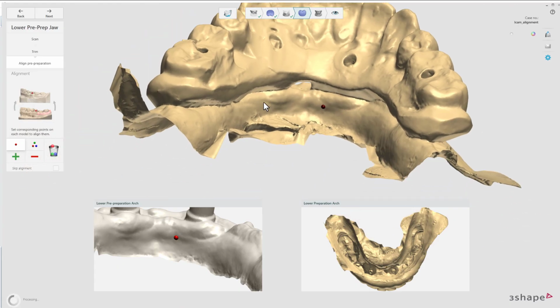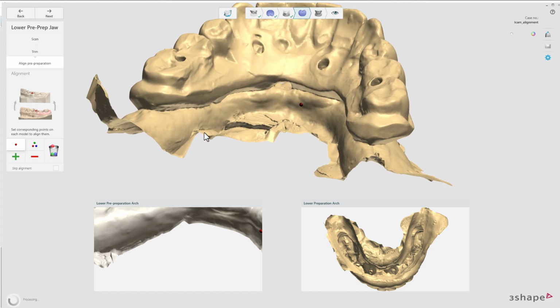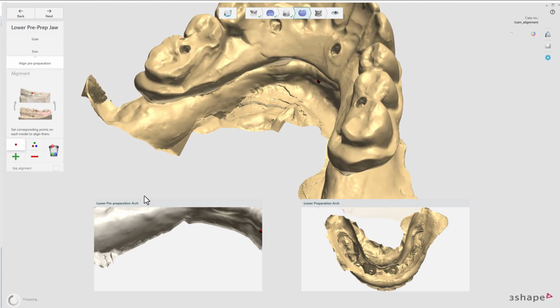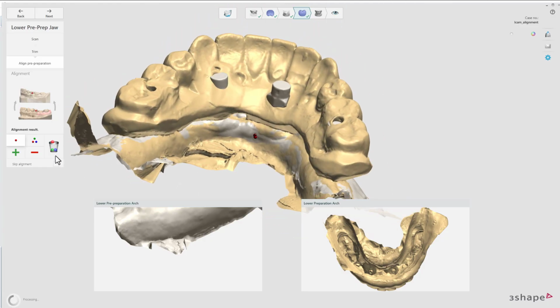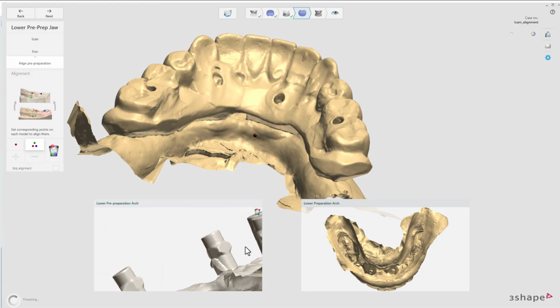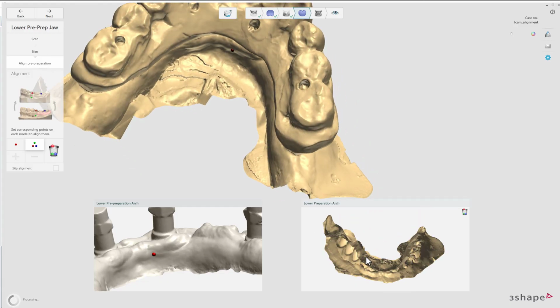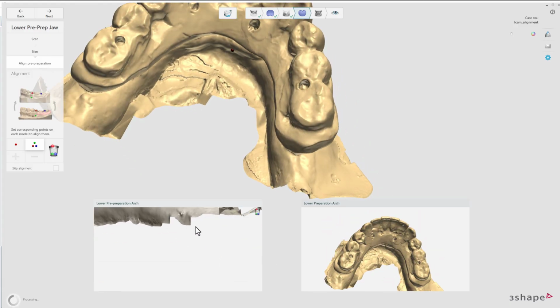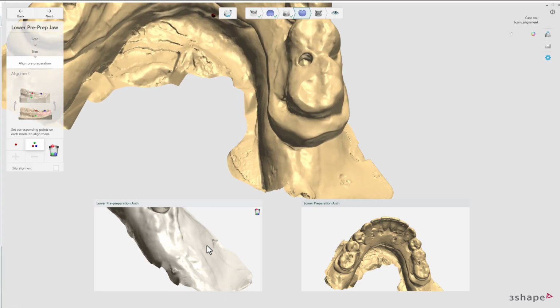It's gonna be right there. And you'll be surprised, a lot of these bumps, they're there. None of these really change. Well, I think you try to do it in one shot. This we'll find.